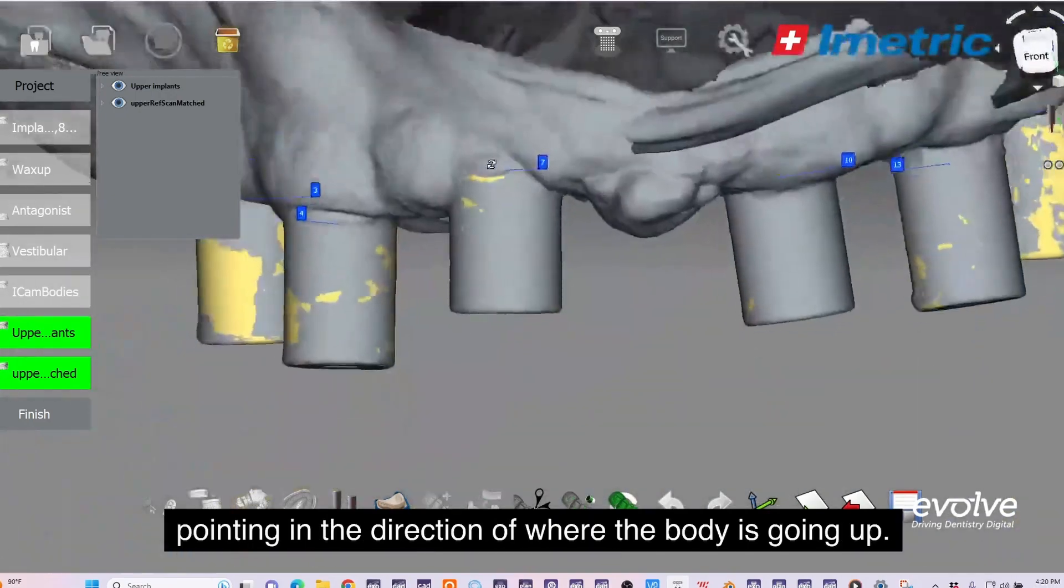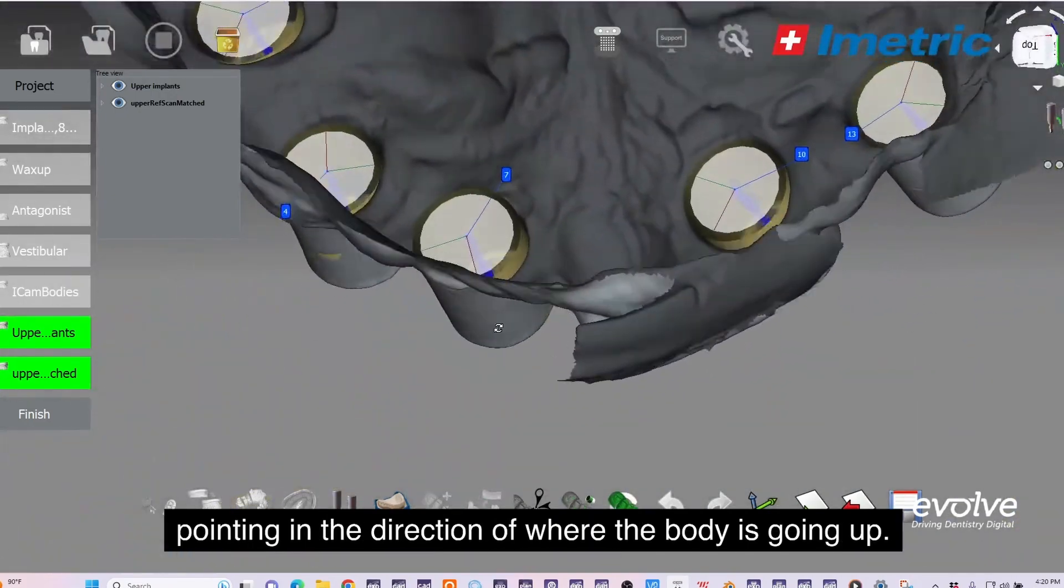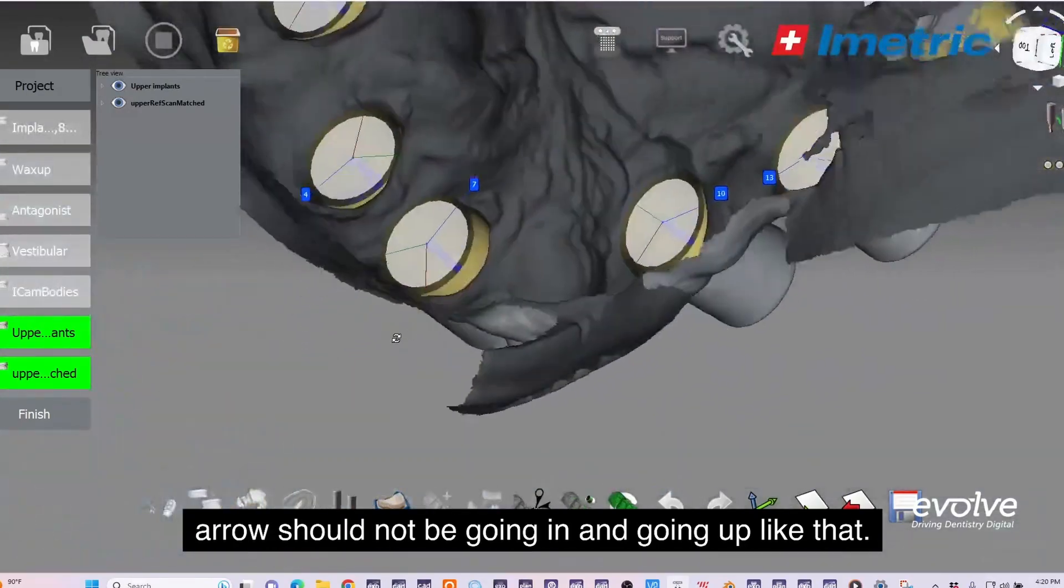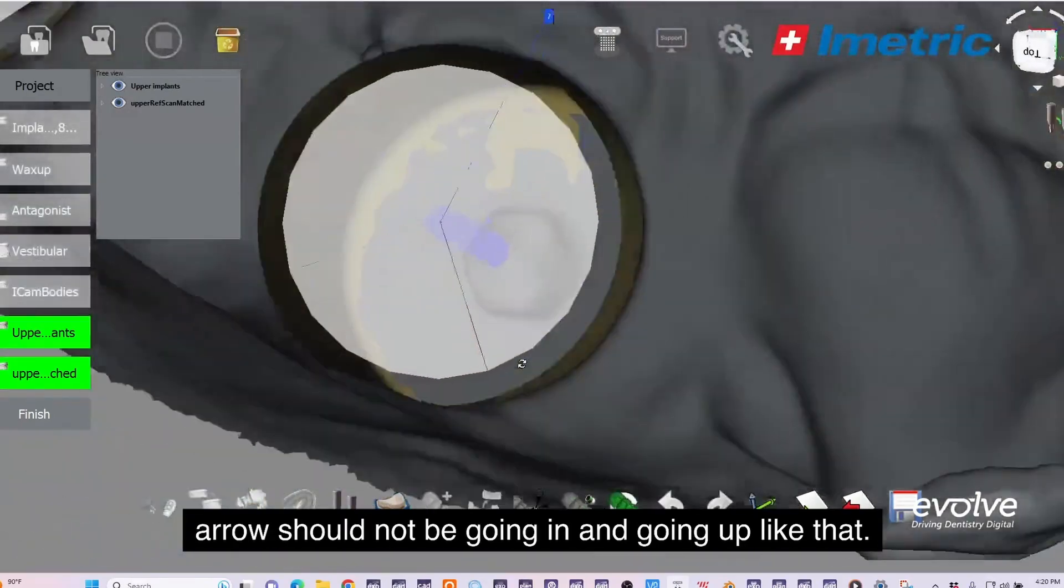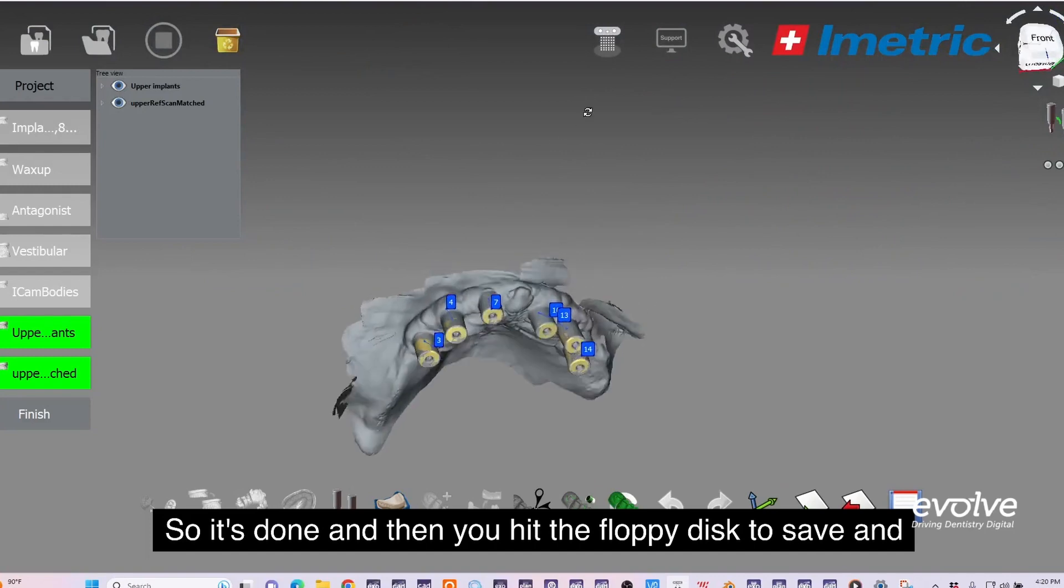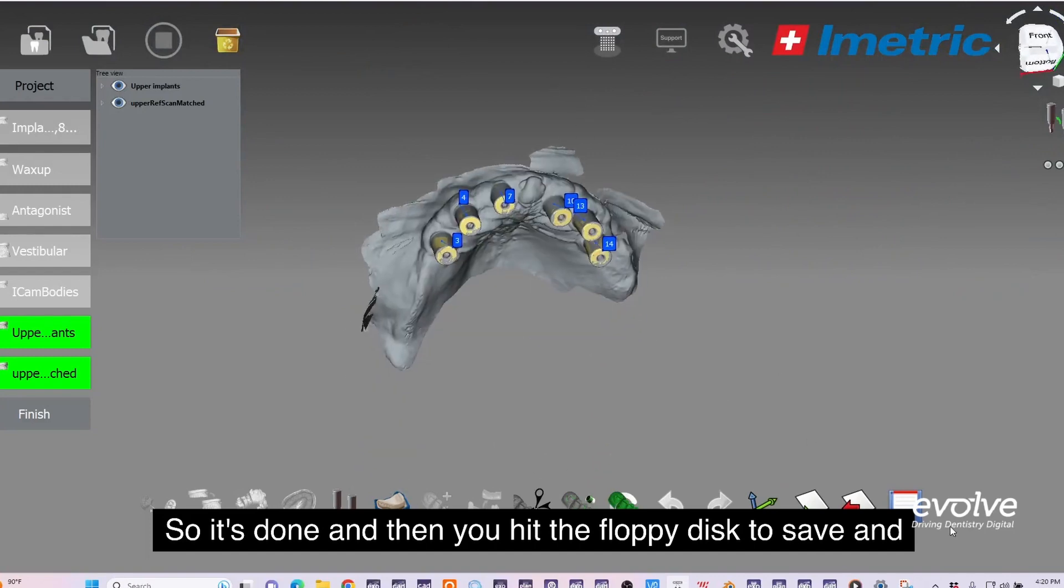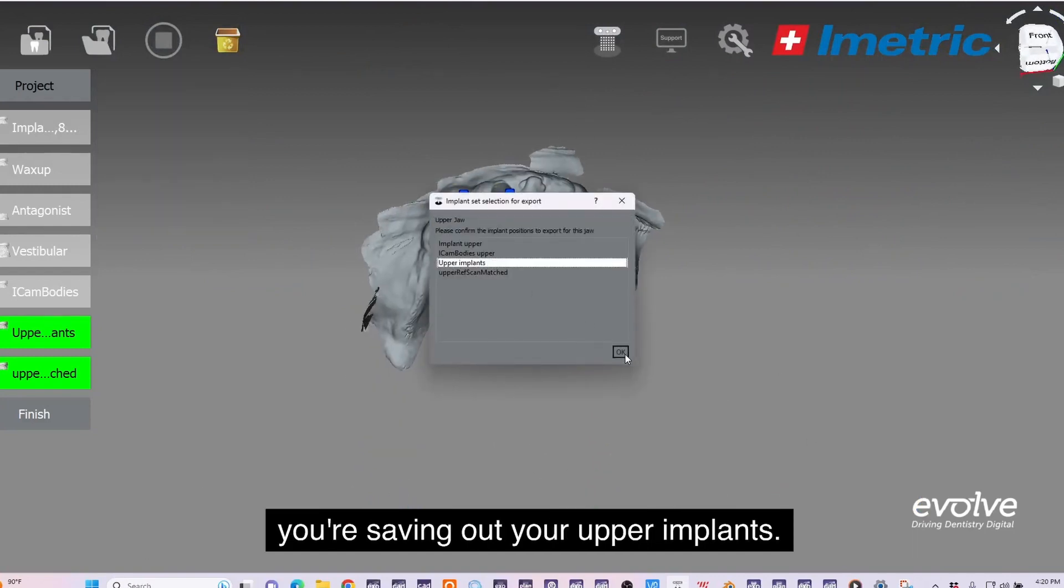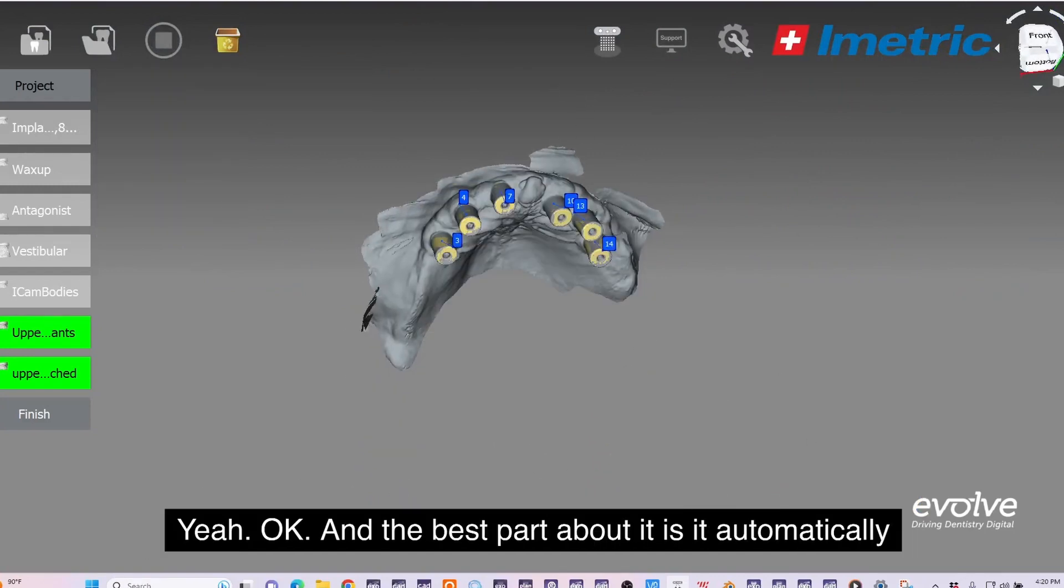Where the ref body is going. Up arrow should not be going in. It's done. Then you hit the floppy disk to save and you're saving out your upper implants.